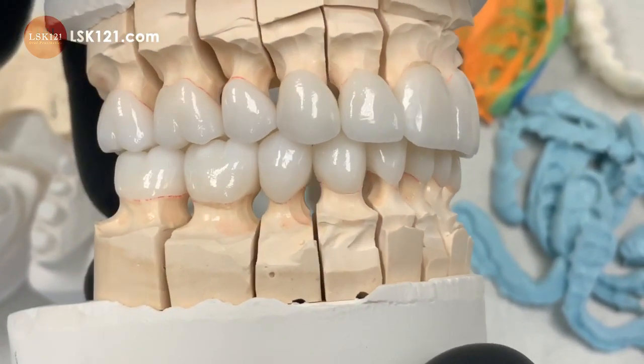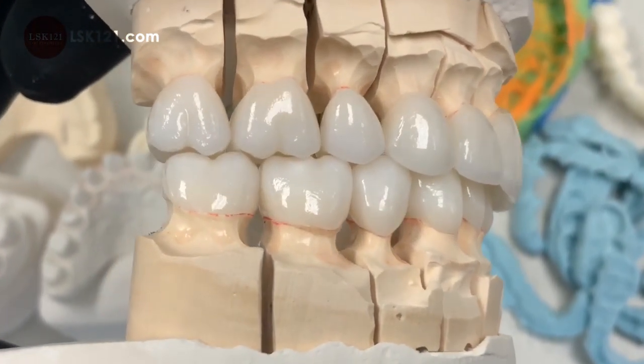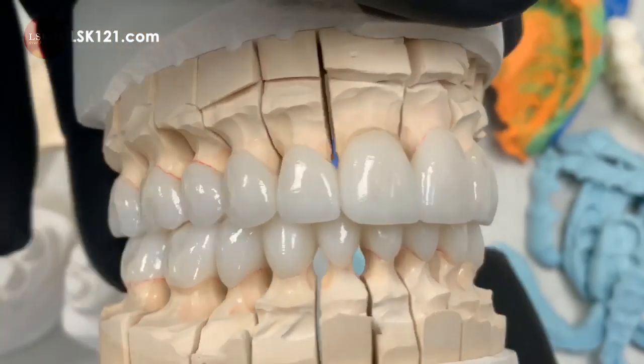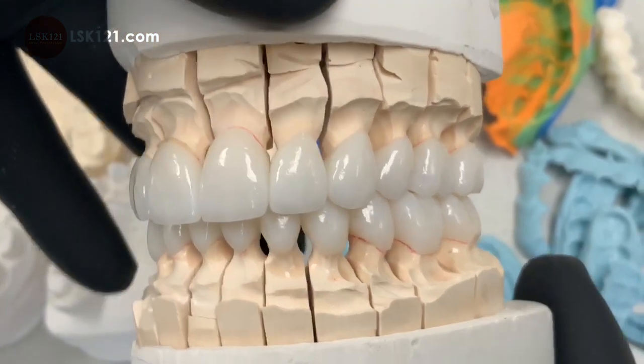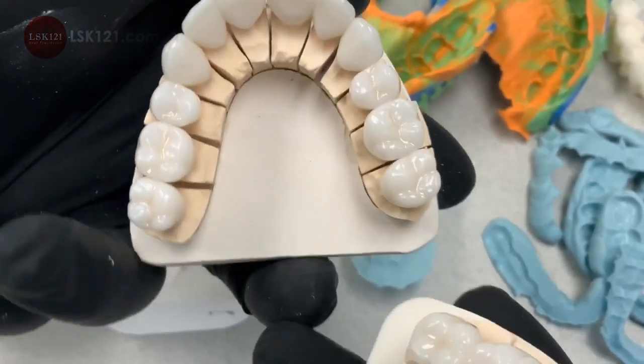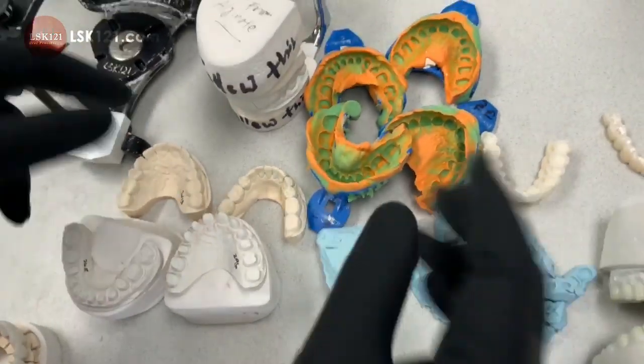Along with the zirconia, it's a monolith — no layer — and then some of the teeth we made with great artistry. Here the occlusion is mono. Let me explain what this is.